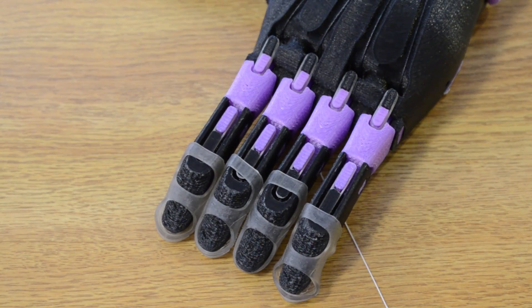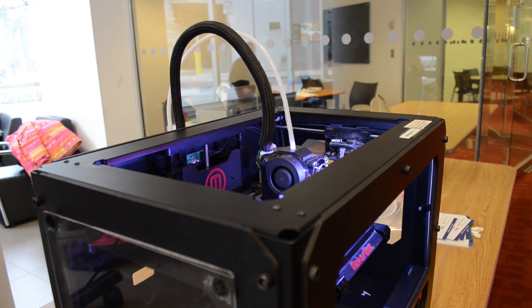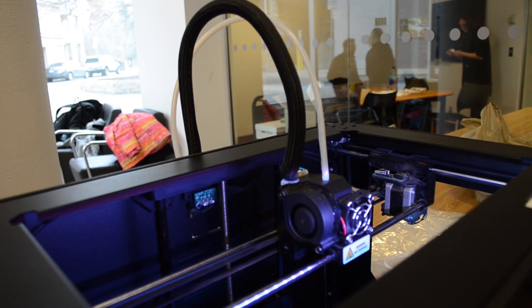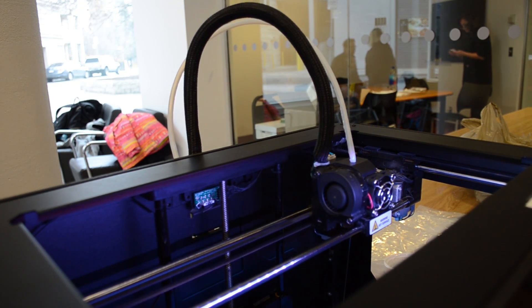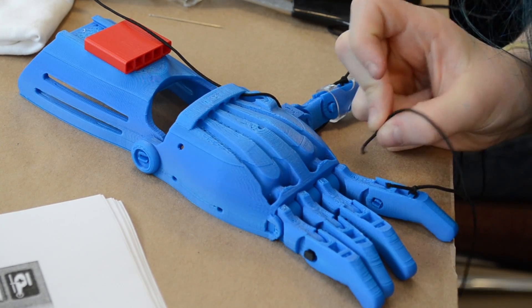So what we are creating are 3D printed hands. They're made with the filament provided by 3D printers. Most of the equipment can be bought at a hardware store and can be printed at a local 3D printer, which can be found at your local library or at your school. They can take those pieces and easily assemble them and then put them in a box and send them off to Enabling, and we will take that and match it with a kid in need.